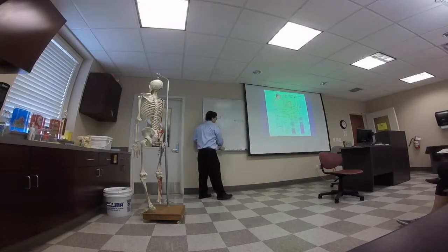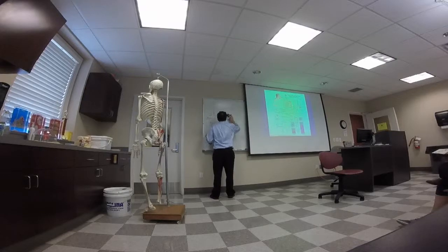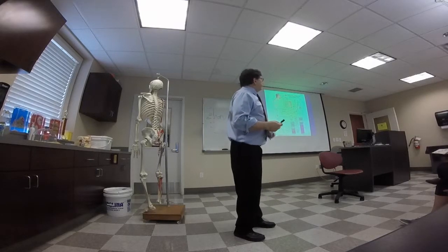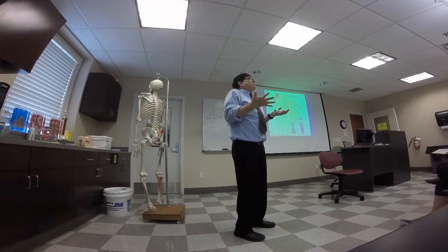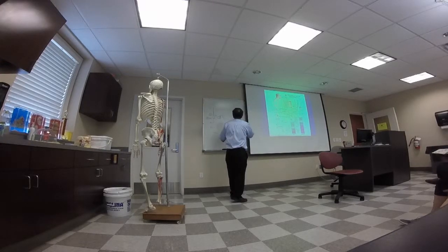Okay. So let's get back to the idea of pulmonary function test. We have this patient breathe quietly, and then the person who performs this pulmonary function testing is a respiratory therapist typically. And the respiratory therapist is going to act like a coach. At some point, she's going to want to ask the patient to take a maximal breath in, so much so that he can't pull any more air in at all. So while he's breathing quietly, she's going to say, okay, now, take a deep breath in. In other words, she's going to get him to keep pulling as much air as he possibly can in until he can't pull in any more.